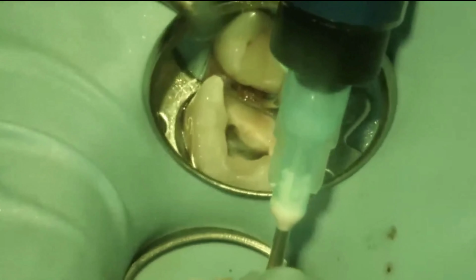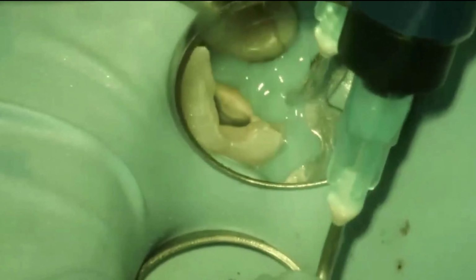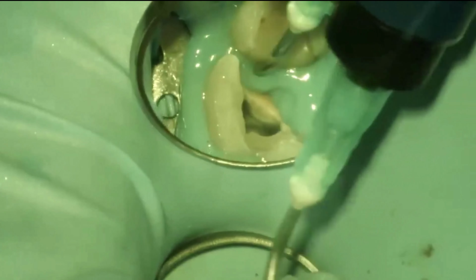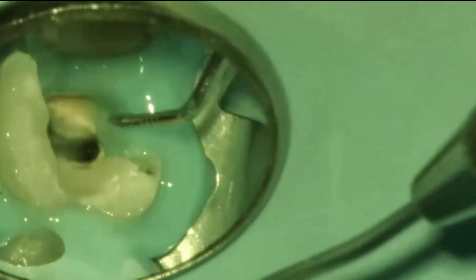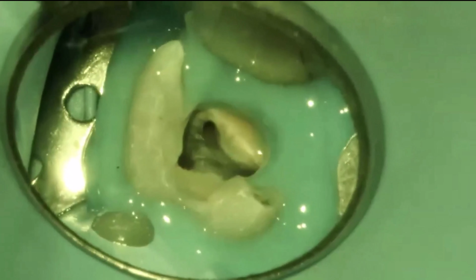And then I'm going to place this directly over the tissue and I'm going to hug the embrasures of the adjacent teeth to get a little bit of retention here. You can see I'm putting quite a bit here. And then I'm going to go to my perio probe and I'm going to sculpt it in and make sure it's sealed. I'm going to up the mag a little bit and I'm going to look down and I'm going to make sure that I'm not leaving any gaps. So that looks good to me. So polymerization, I'm going to add more.